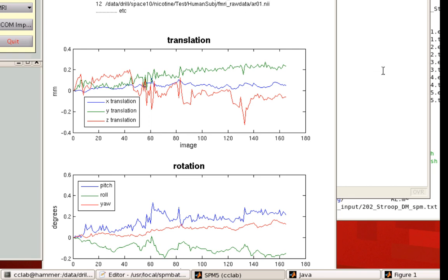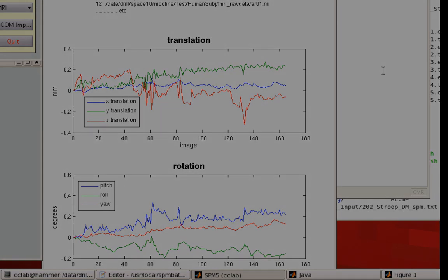That's how you run realignment within the SPM graphical user interface. In the next tutorial, we'll cover how to run it from the command line using the SPM Realign and SPM Reslice commands.